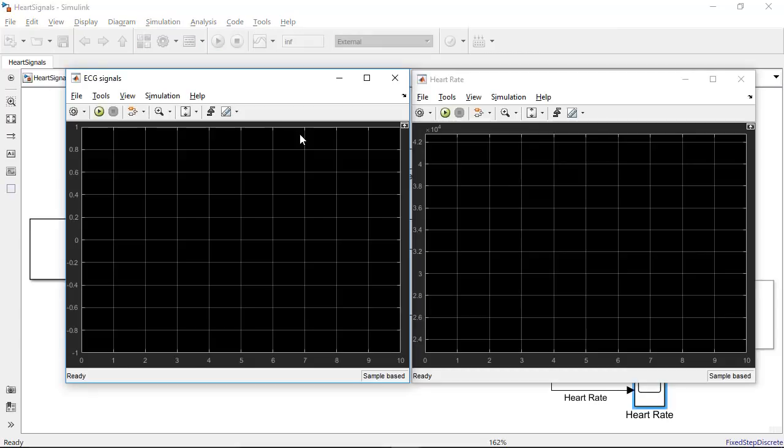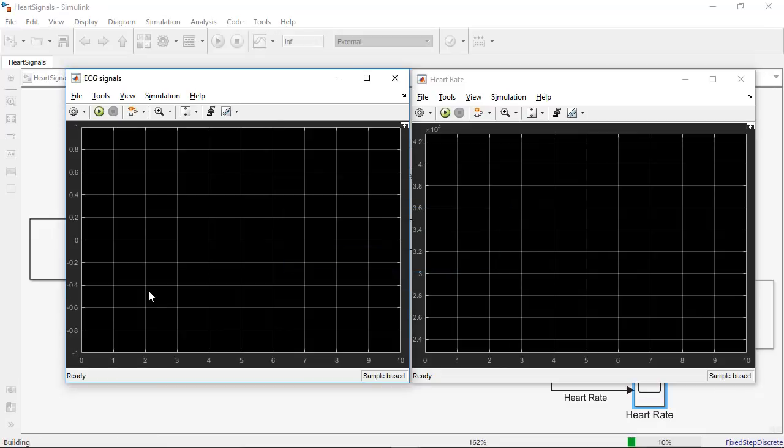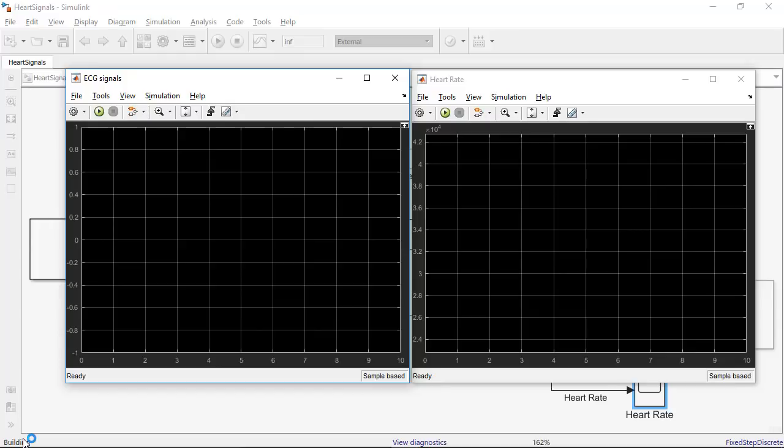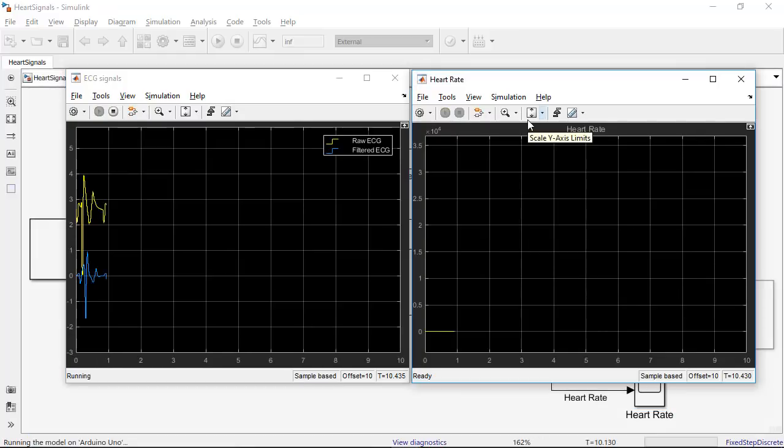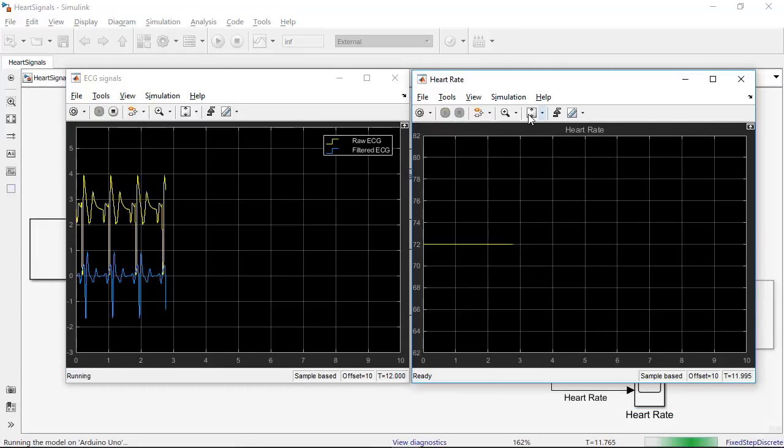So when I press the play button, Simulink is generating the code equivalent for this model and it is compiling it into an executable and downloads it directly to the Arduino. The Arduino then sends the points of data that I am probing serially back to Simulink and that is how I am able to visualize it here.